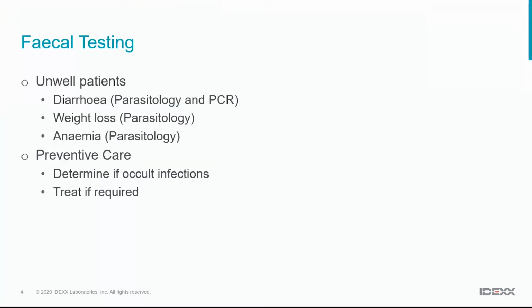And so doing good quality parasitology in that setting is helpful to determine if we need to treat them or not. And then there's the consideration these days of whether we should be testing before we treat? So, doing parasitology, if they're negative, they don't necessarily need to be treated for intestinal parasites, but if they have a positive result, then we would treat them for that.